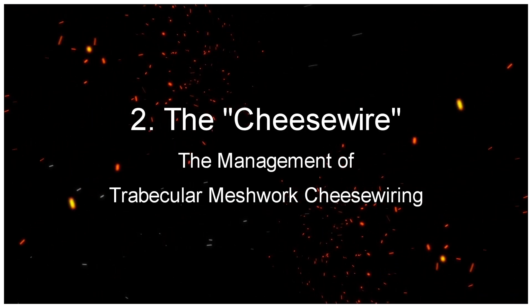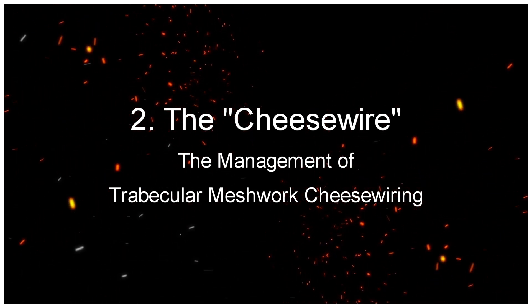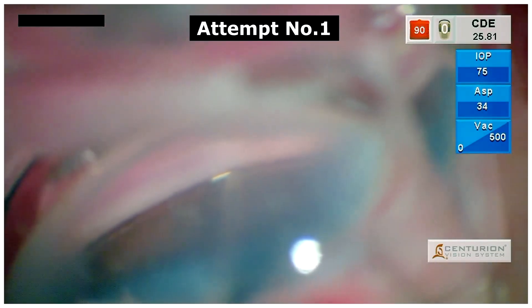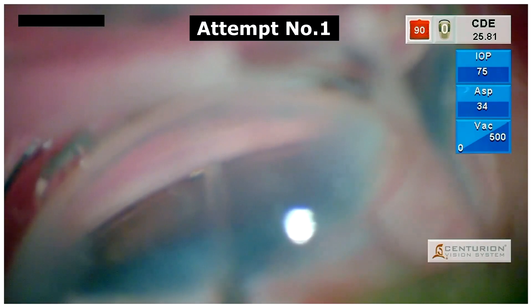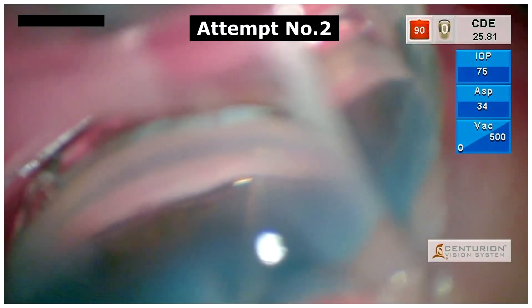The Cheese Wire: The Management of Trabecular Meshwork Cheese Wiring. Every trabecular meshwork has a different consistency. Here we have a case of a very friable trabecular meshwork which cheese wires on multiple attempts for implantation, as seen here.